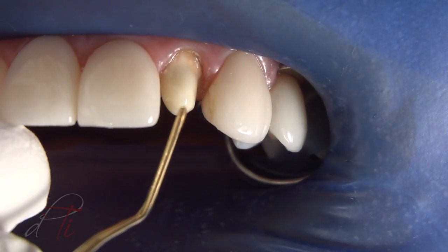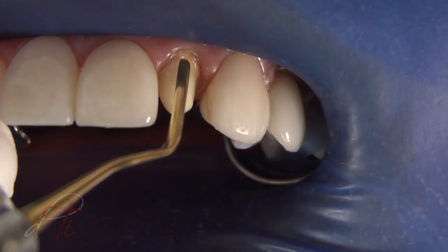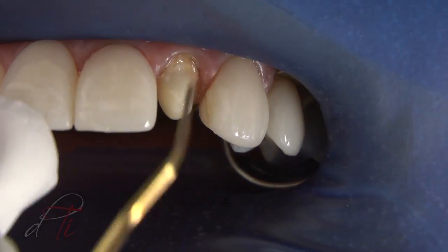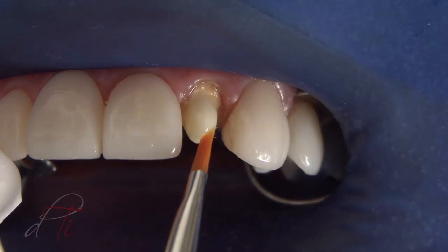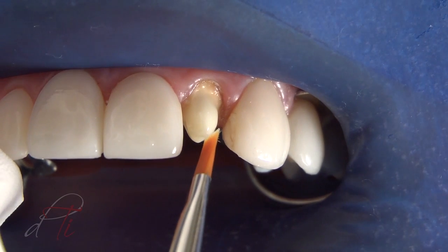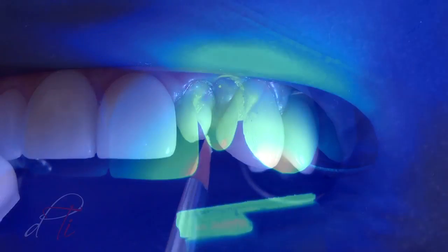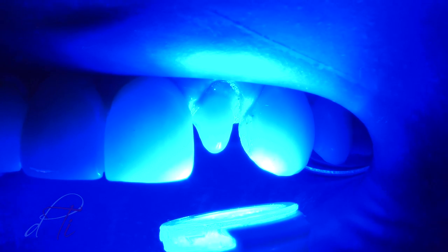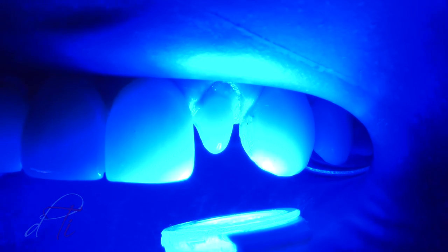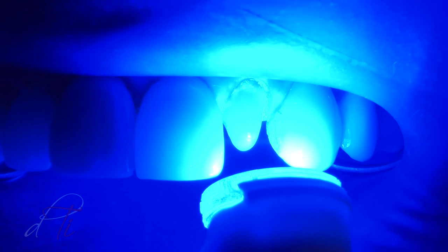The core build-up material was applied and adapted using a long-bladed interproximal instrument. It was then sculpted and smoothed with a number two sable brush into the desired geometric shape, form, and dimension of an ideal preparation. Post-cure is performed for two minutes to improve the degree of conversion and ensure the hardest surface possible, placing the curing unit tip as close as possible to the surface.